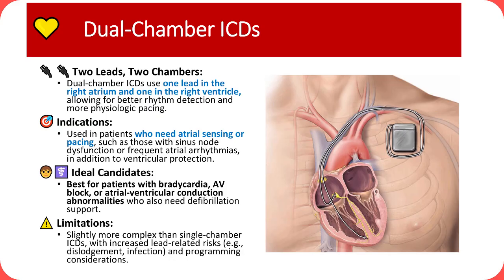Ideal candidates include individuals with bradycardia, AV block, or other atrioventricular conduction abnormalities who need both pacing and defibrillation capabilities. However, these devices are more complex than single-chamber ICDs and carry higher risks of lead-related complications like dislodgement and infection, as well as programming challenges.